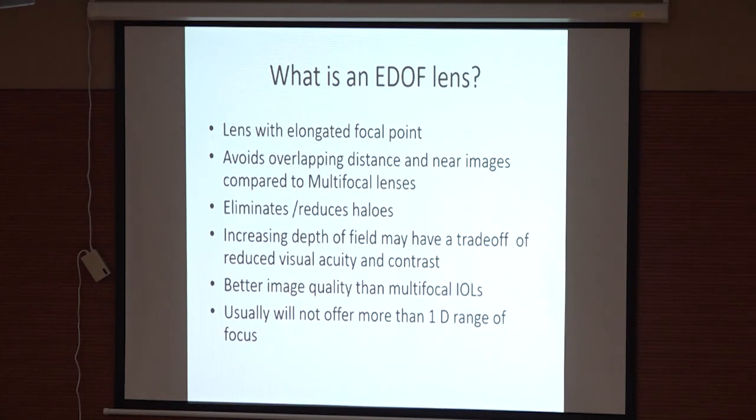And like I said, because of that trade-off in the contrast and the distance vision quality, usually these lenses will not have more than one diopter range of focus. If we increase that range of focus, we start getting into the problems that we had with the refractive multifocal IOLs, which were available many years back.